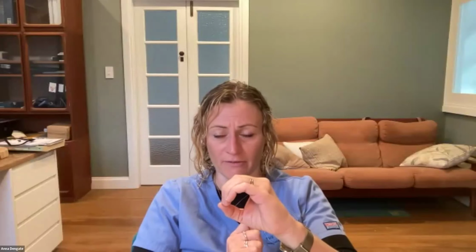So you've got the aorta in cross-section in that view, and it will be just kind of off the side like that. So when you're getting your LAAO view, you always fan up and down that aorta. So you go post-valvular, valvular, and then subvalvular space just to find your right location, and you will stumble across it in that view.